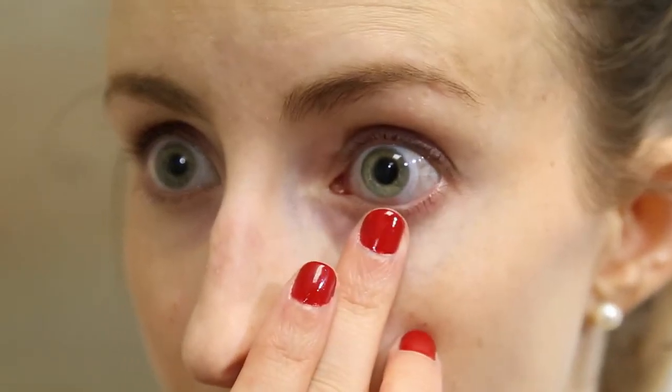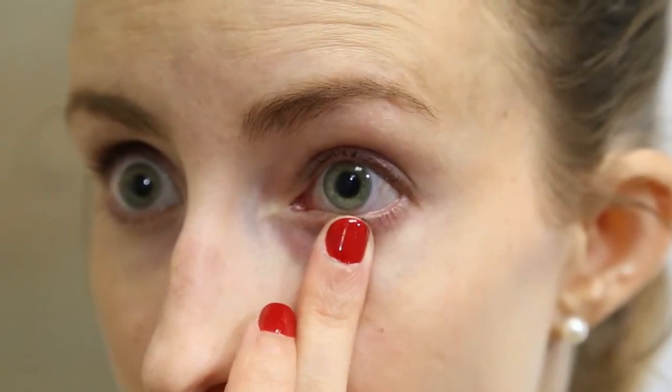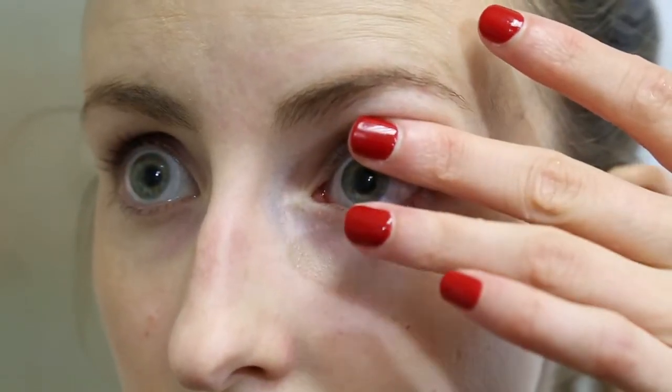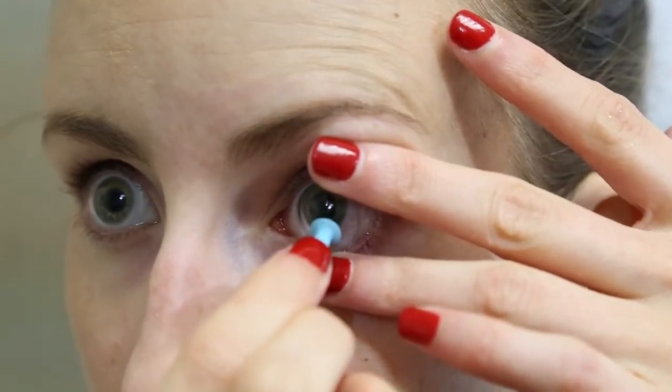Take the edge of your lower lid looking into the mirror and put a slight pressure on the white part of the eye under the lens edge to try and break suction. This will put a bubble under the lens. Once the bubble is under the lens, place the small plunger on the bottom third of the lens and pull the lens straight off the eye.